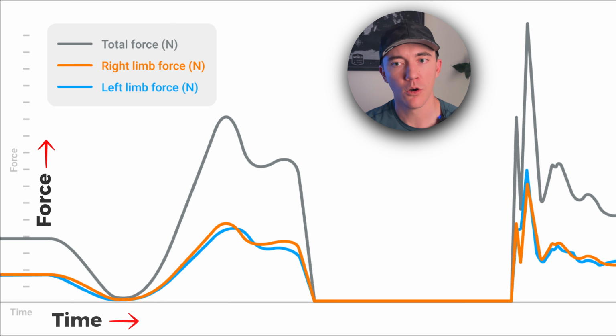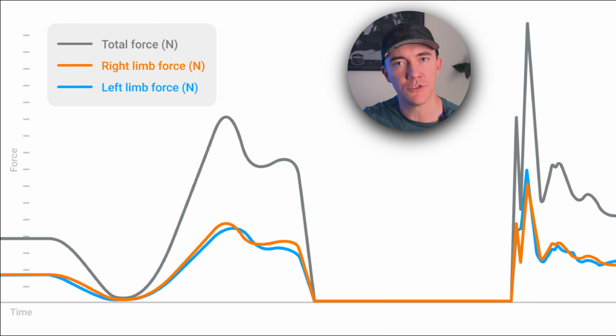A force time curve is a running graph that tracks the forces being put down into the plate over time. As things are running longer and longer, your time continues to go on, and as the forces are being put through the plate, you'll have forces going up and down and time that continues to run. After you finish your assessment process, you'll have this really long graph because time has gone on, and then you'll have instances where you have your assessments performed and you'll be able to see some really common patterns.